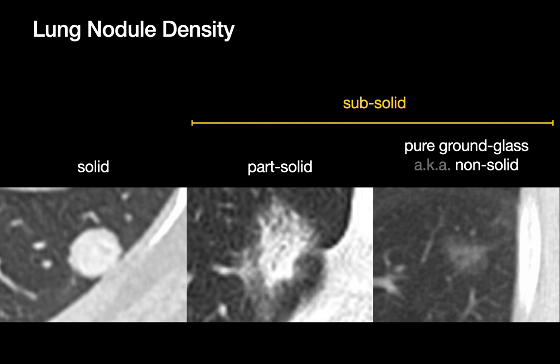Next item: lung nodule density. When we look at and describe the density of a lung nodule, we tend to categorize them in terms of one of three density types: solid nodules, ground glass or non-solid lung nodules which are basically see-through, and part-solid lung nodules which have both ground glass and solid components. It's not uncommon to refer to part-solid and pure ground glass nodules together as sub-solid.